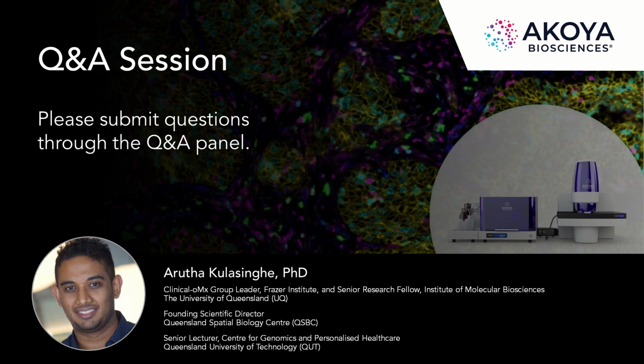And one of the really exciting things for us working with Akoya Biosciences was that we could see that there were a number of organizations, the Jedi Council, and a few other of these organizations, Astropath, and assay standardization working groups around the world, where they were running the same sample across multiple labs, and they could get robust data across them. So having reproducibility, standardized assays that you can run across the world in multiple labs and be confident in what you're reading is really important. You shouldn't have much assay variability. Those pre-analytical conditions are really important.